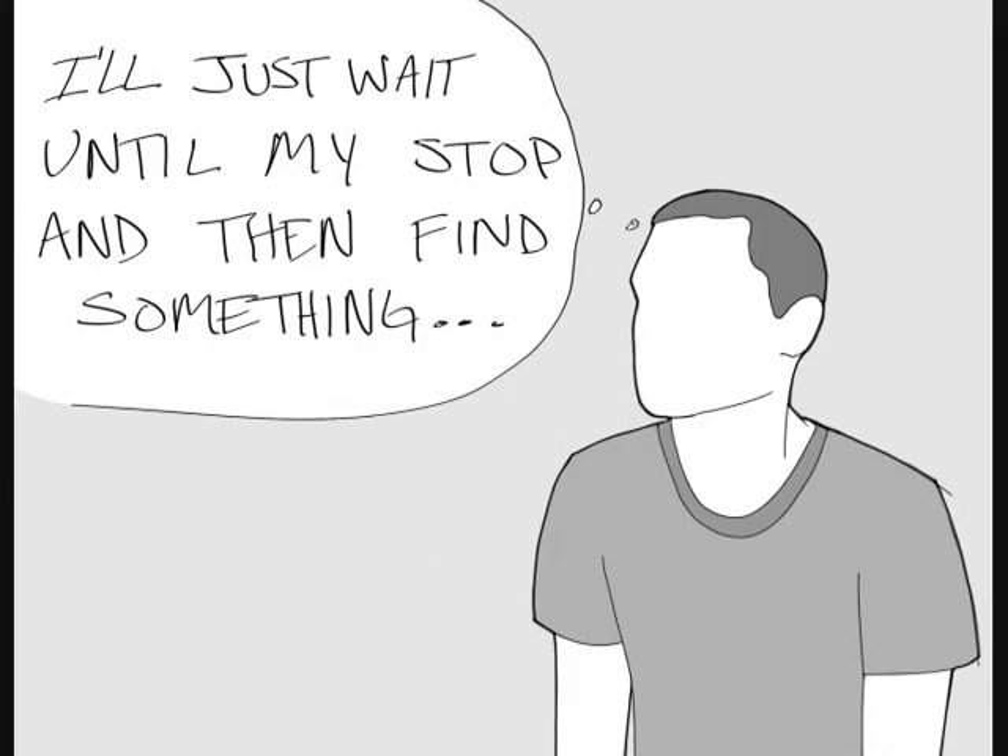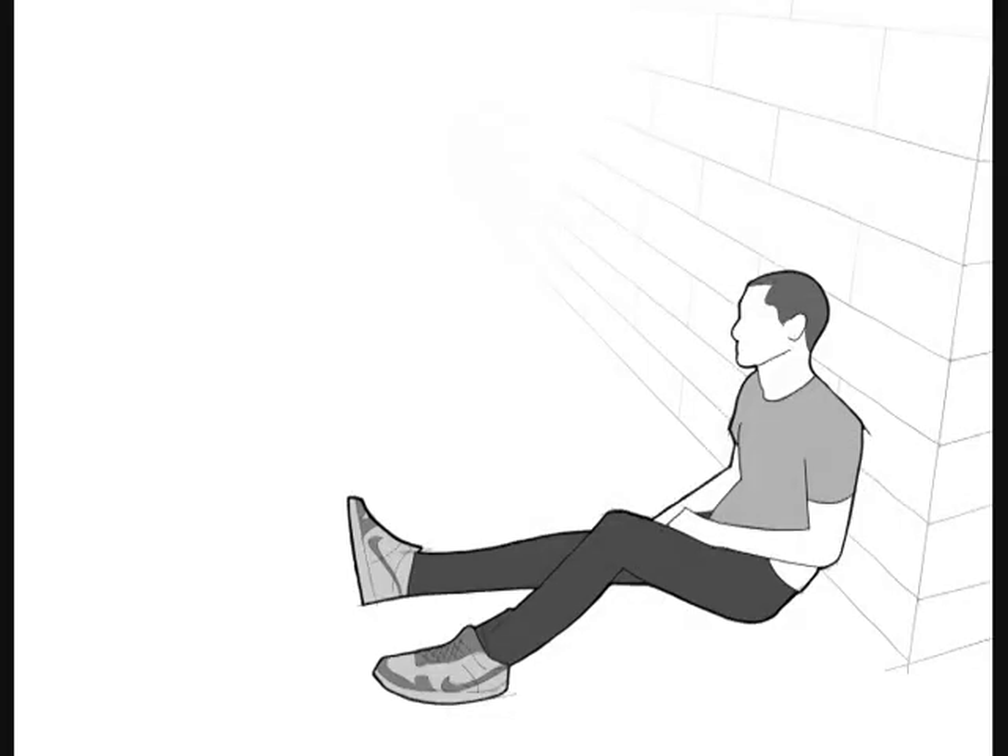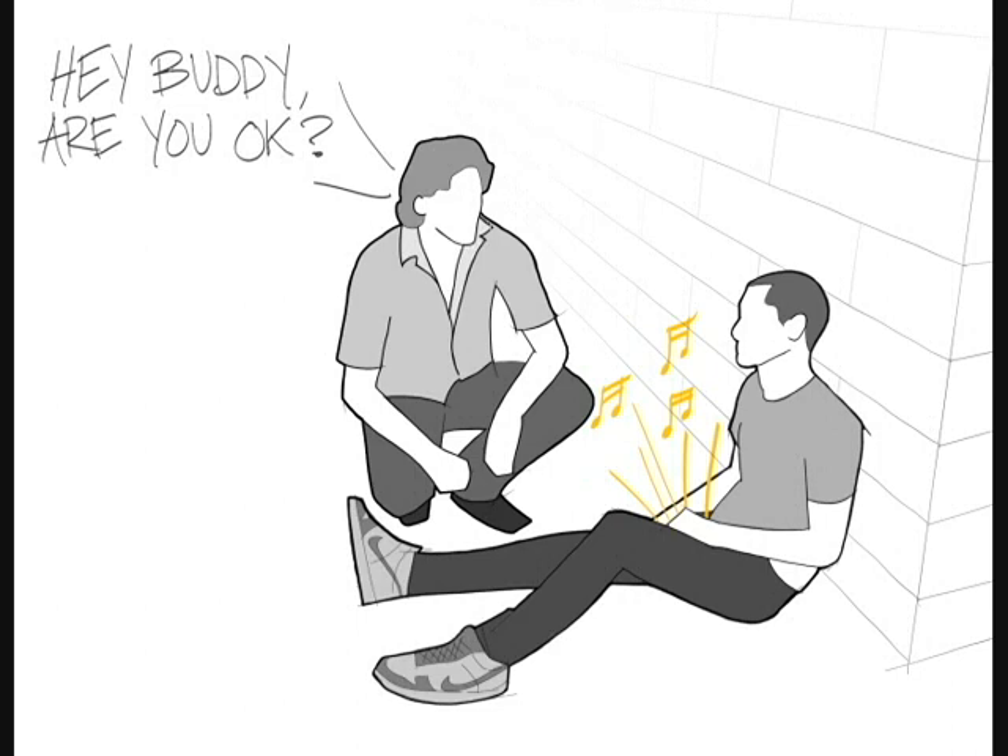By the time he gets to his stop, he's in a haze and ends up passing out at the train station. Most people walking by assume that he is just drunk until the alarm goes off again and someone stops to help.